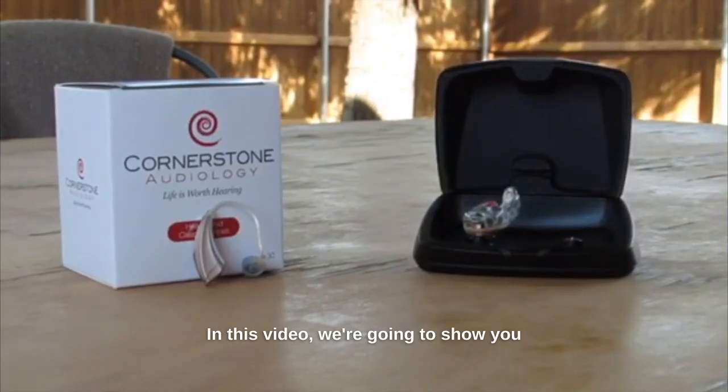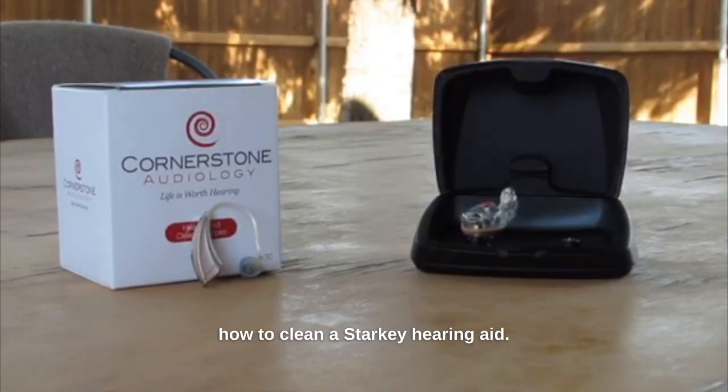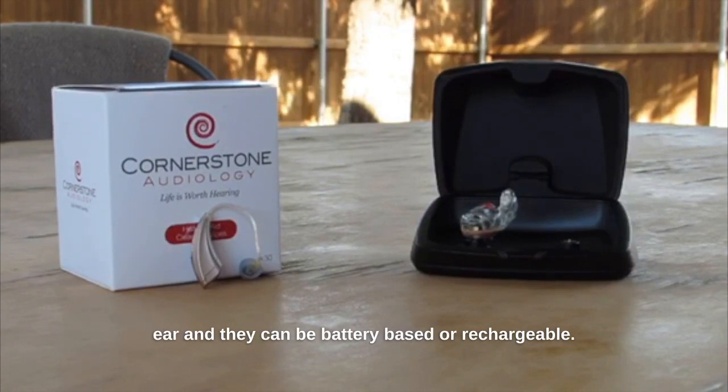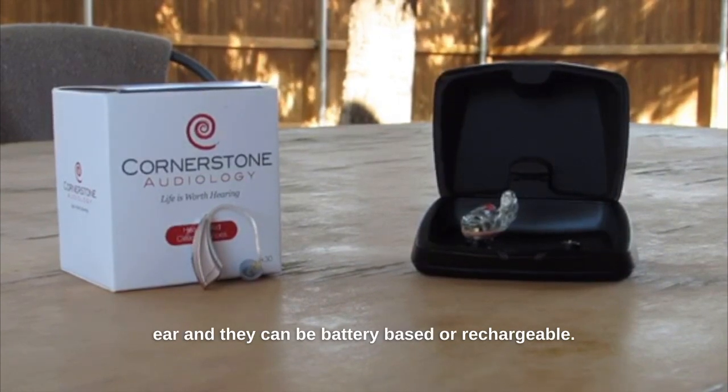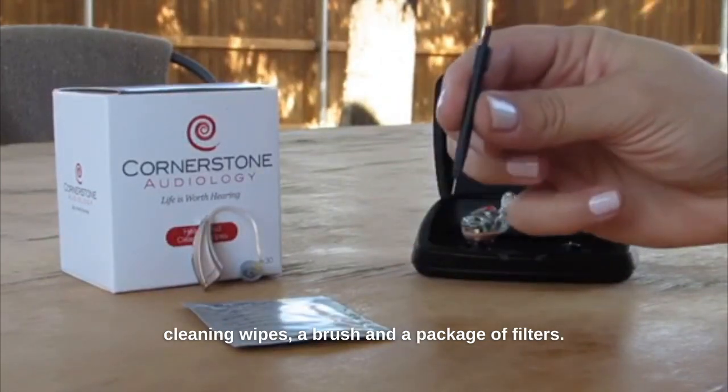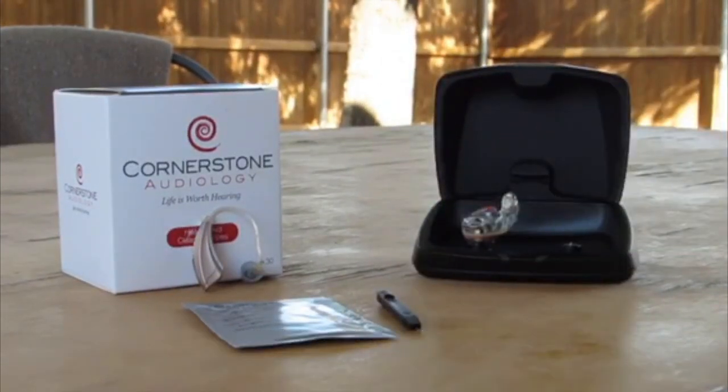In this video, we're going to show you how to clean a Starkey hearing aid. These hearing aids can come in custom or behind the ear, and they can be battery-based or rechargeable. So to get started, you'll need a package of cleaning wipes, a brush, and a package of filters.